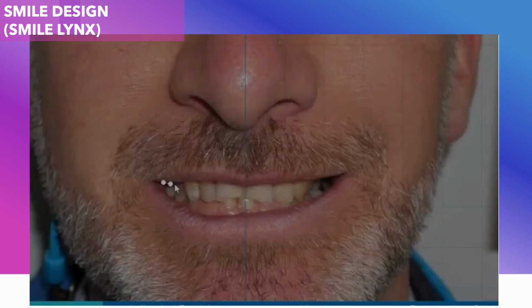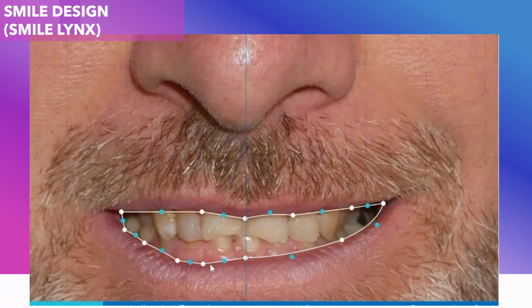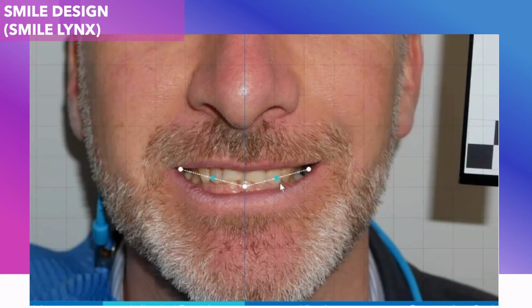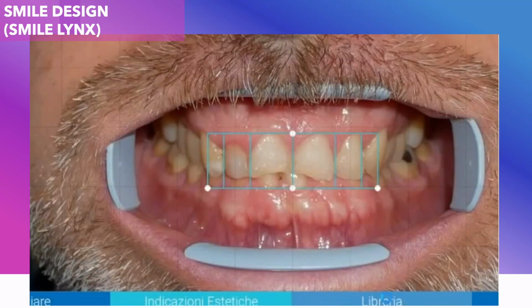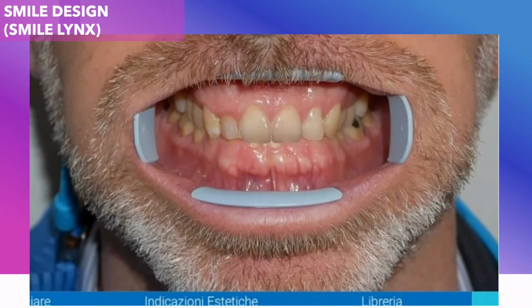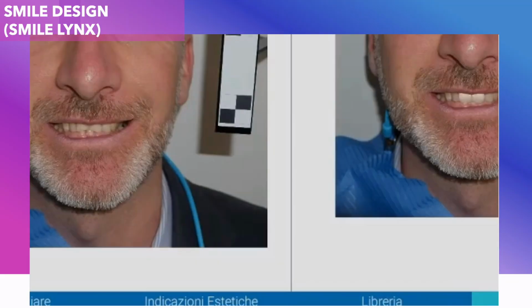In modern smile design software, a mesh can help the clinician in the alignment process according to the midline and to other planes, just like the bipupillar one. Transposition and rotation of pictures are at this point possible. It is now possible to determine the smile working area by easily tracing the lip contours with an assisted software technology. We can draw the smile line and also point out our reference planes. We are able to plan our direct and indirect restoration, and we finally can present the outcome and discuss it with the patient. It is also possible to make measurements and draw arches on soft tissue to present future surgical intervention on periodontal tissues, just like in this clinical case.